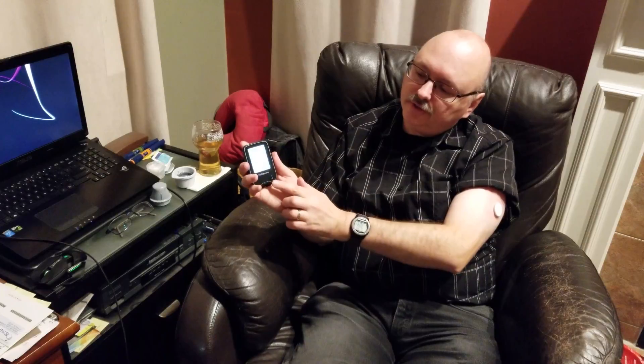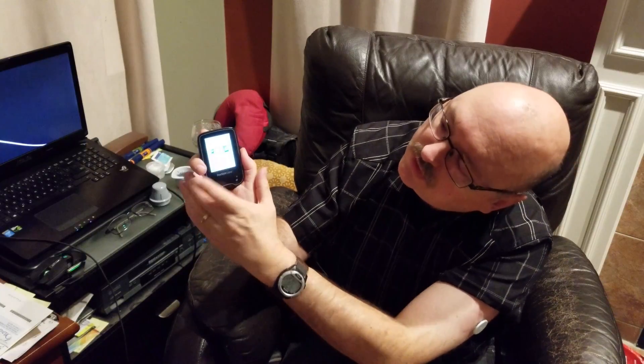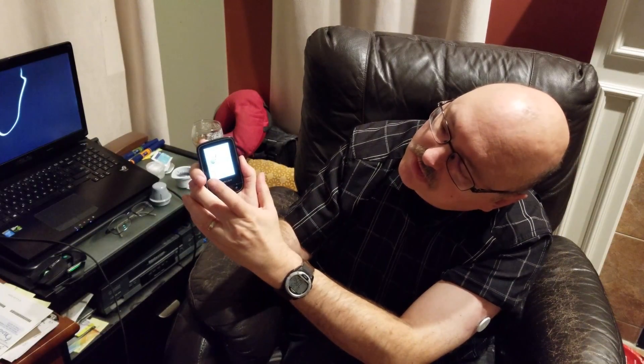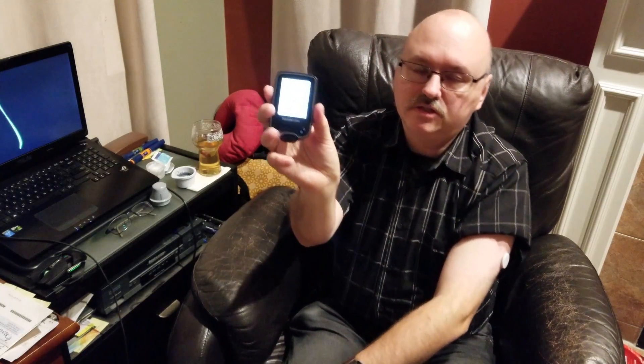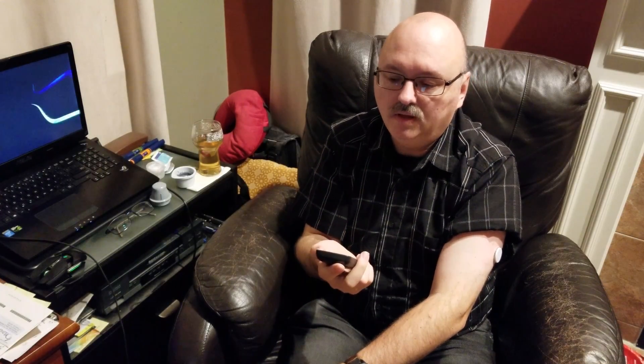Now we have to activate it. Activating it is simple — take your reader, push the little button to turn it on, and it says 'Start new sensor.' Just touch the button, it says 'Start the new sensor — scan the sensor to start it.' Now it says it's going to be ready in an hour, and after that you'll know your blood glucose level.